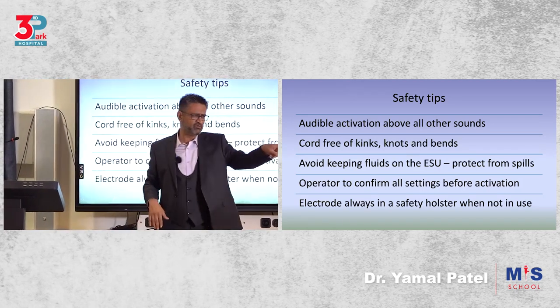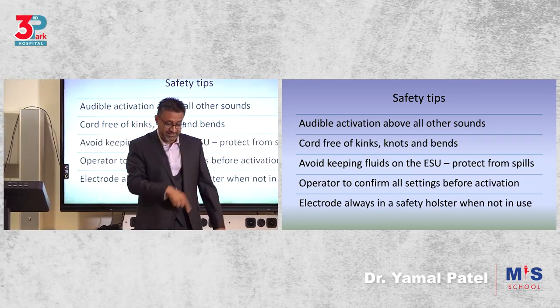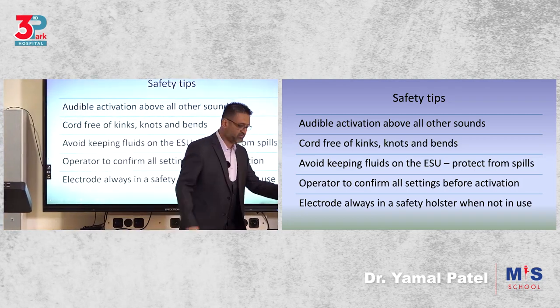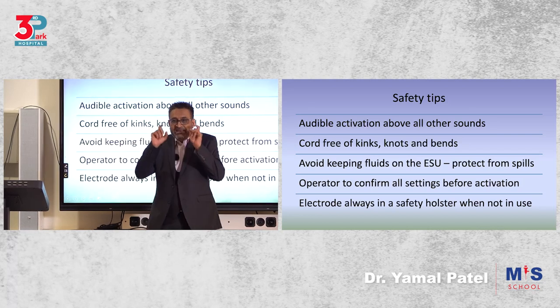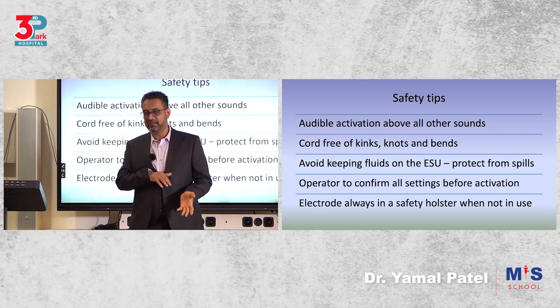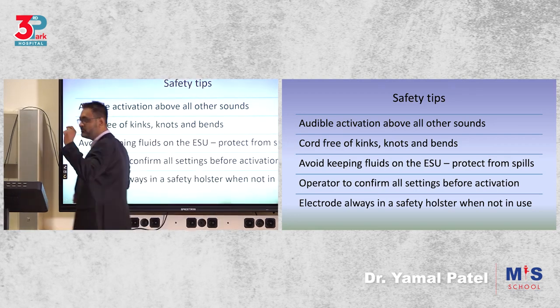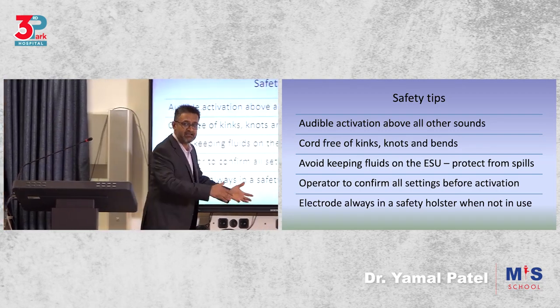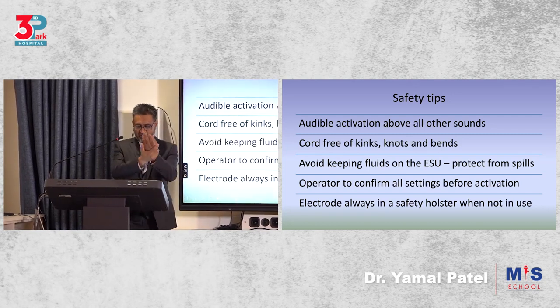Why? Don't say that's noisy, reduce the volume and you have your music. Fine, have your music, but that volume should still be loud so that when this instrument is lying on a patient somewhere or it's in there and the nurse or your assistant is just by mistake pressing it, you'll hear the ting, and you'll be like, who pressed what? Immediately, and then you look for where that electrode was. Because if you don't, then it will burn something. If it was lying on the patient, it will burn here without you knowing. Okay? So it should be audible. It should be loud when you activate it. So if someone activates by mistake, someone hears it immediately. The cord should be free of kinks and knots, so don't try and have knots in the cord.